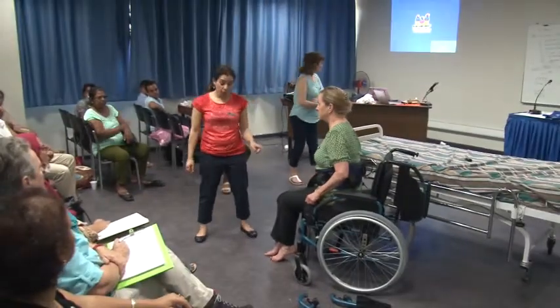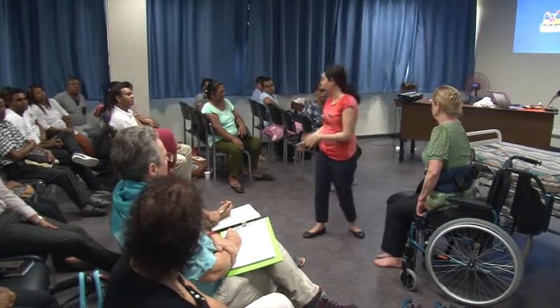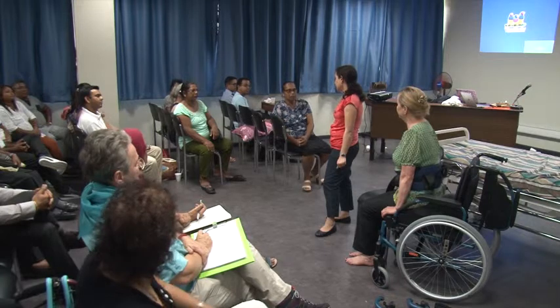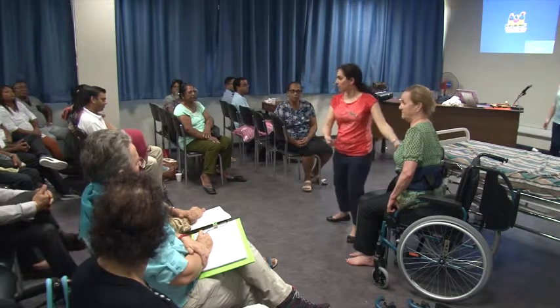Again, a person who has the ability to stand, you would only stand that person. If they don't have the ability, then you don't stand them. That's what it is; this person has got the ability. How you lift a person who does not, when you try to transfer, is using a slide board. We're going to come to it now. For those who can stand for a while, you still use this, yes.